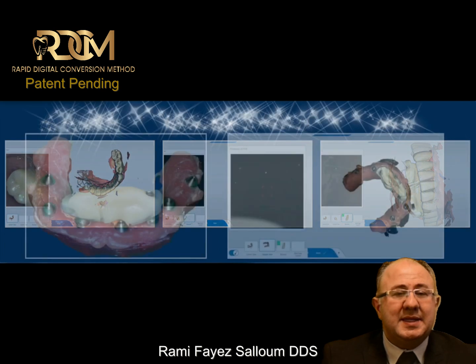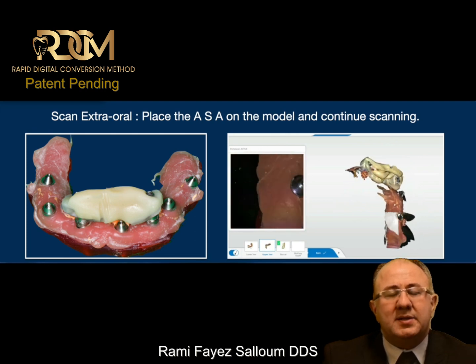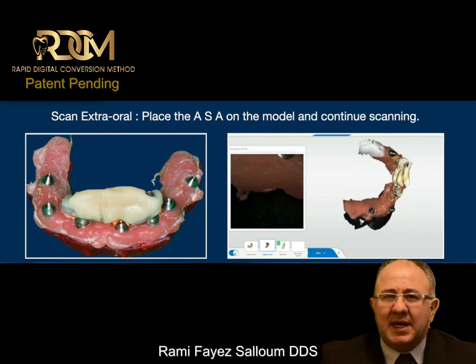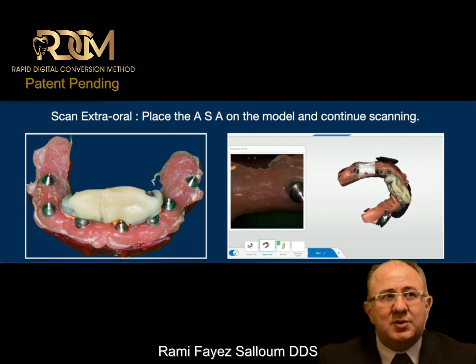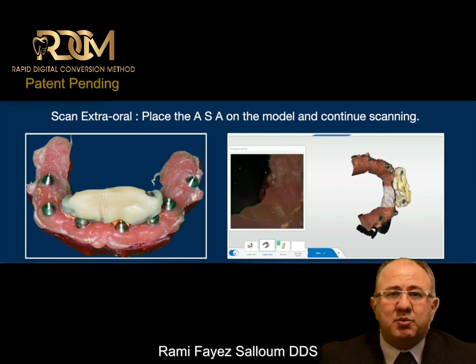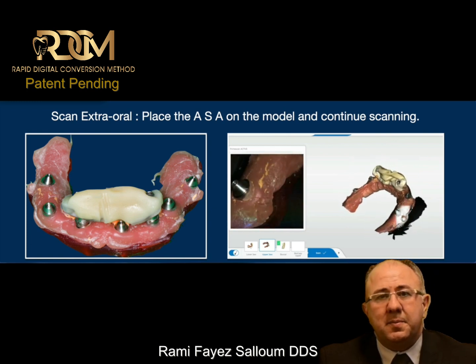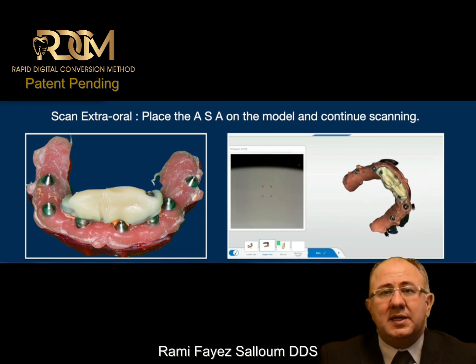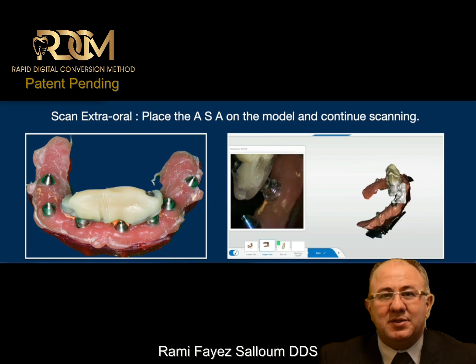The next step: I take the ASA out, install it on the model, and then I go back to the same scan — the same intraoral scan. Our scanners are very powerful machines; they understand stitching. As soon as the scanner sees the ASA, it will capture it and will continue the scanning process without knowing it is scanning a model. The scanner thinks we are still scanning intraorally inside the patient's mouth, and that is how we get the model mounted perfectly in occlusion.